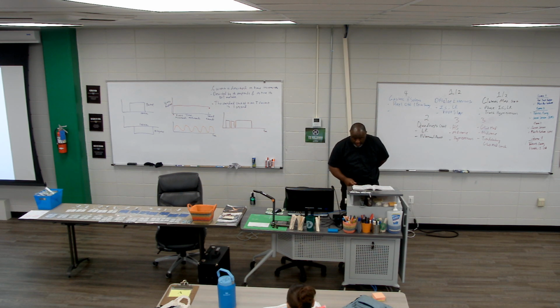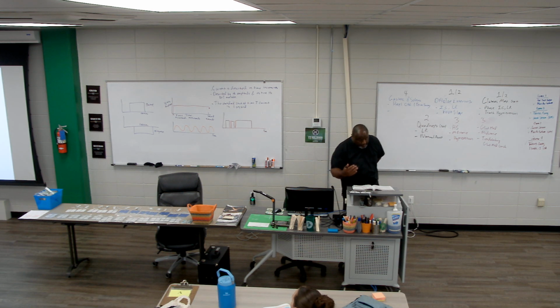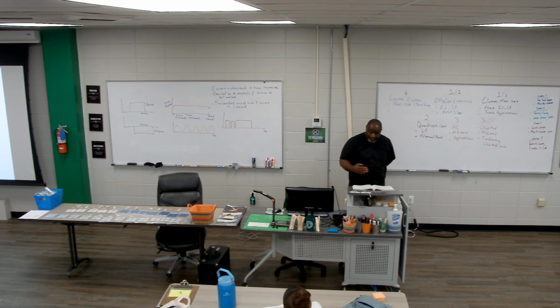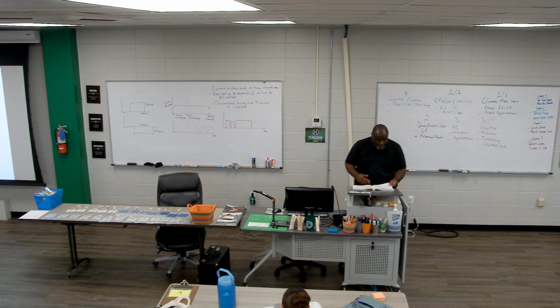I don't want to go into too much of that. So the next waveform type we could have, other than monophasic, is biphasic waveforms. Biphasic, this is where we start to dive into some specifics. Let's go to polyphasic again, and then we'll come back to biphasic.